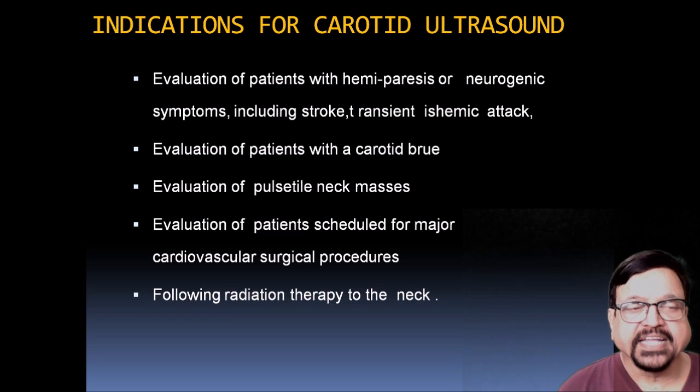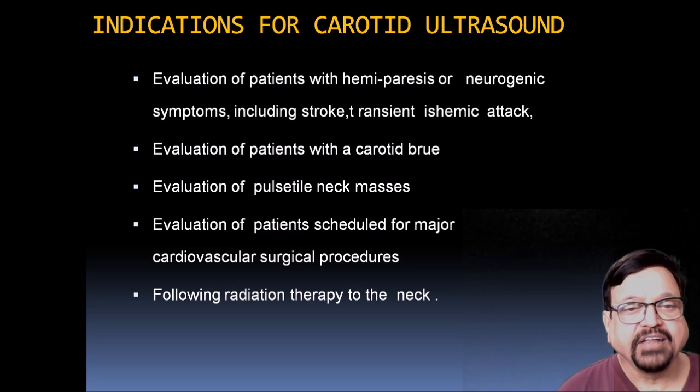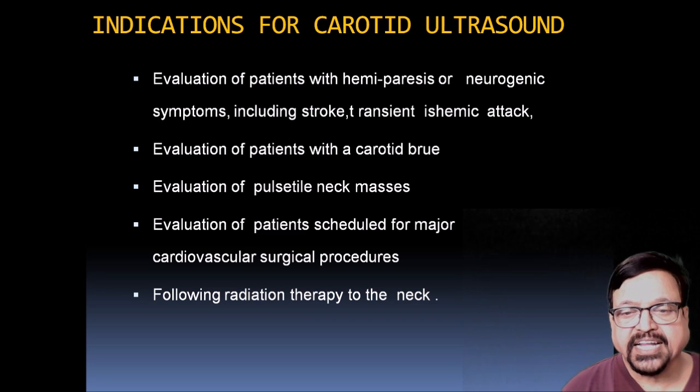Now let's come to the radiology. Indications for carotid ultrasound. Evaluation of patients with hemiparesis or neurogenic symptoms, including stroke and transient ischemic attack, are the main indications for common carotid artery Doppler evaluation.